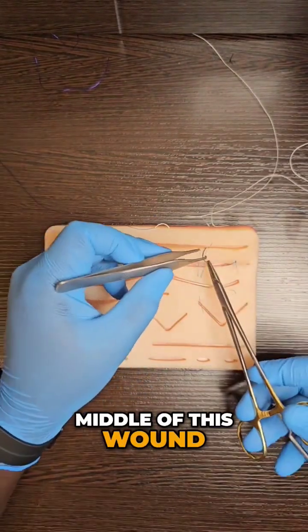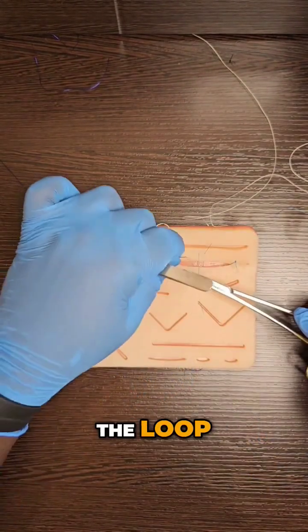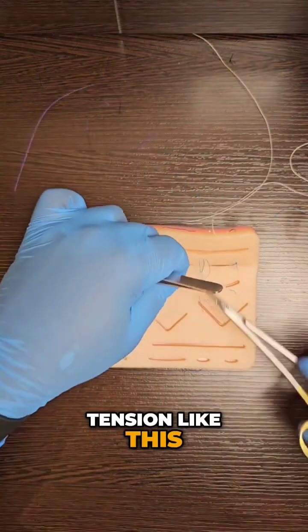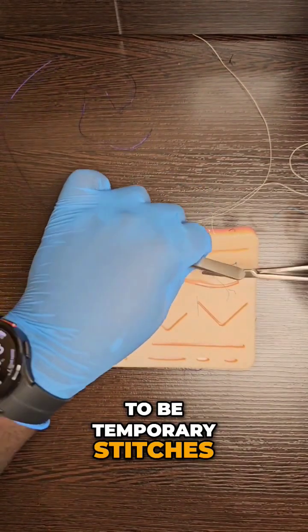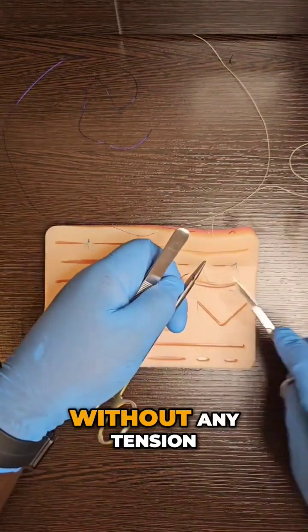I've passed it through the loop. That's what makes it locking. It takes out the tension like this, and these are going to be temporary stitches for me to put in some deeper sutures without any tension.